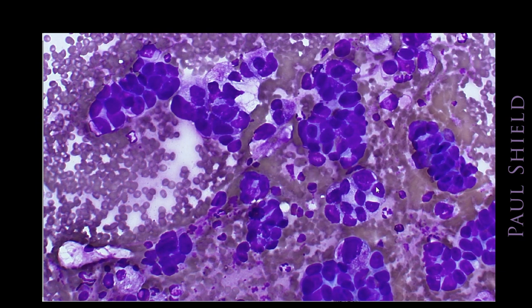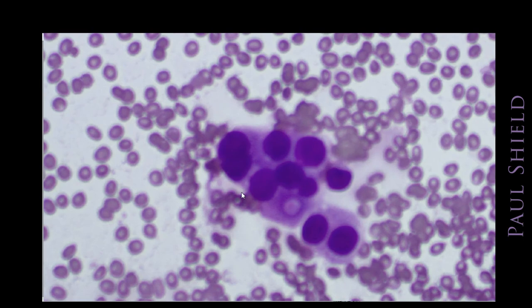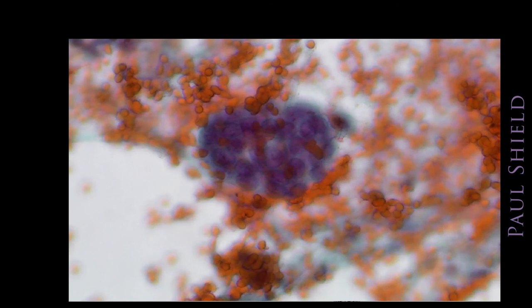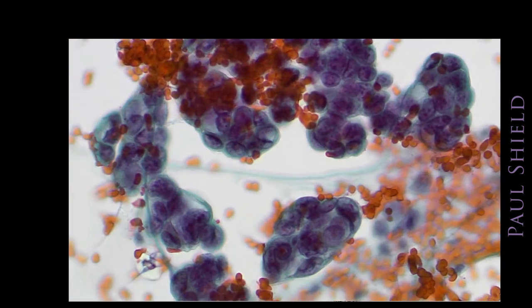Often you'll see them like this. These are very glandular looking arrangements with nuclei arranged around the outside of the group and a reasonable amount of cytoplasm. A few more examples. This one on higher power, you can see even has a cytoplasmic vacuole on the bottom there. And notice how the nuclei are mostly arranged around the outside of this group. That really just reflects the fact that these are columnar cells, and that is a feature that persists even in adenocarcinoma.